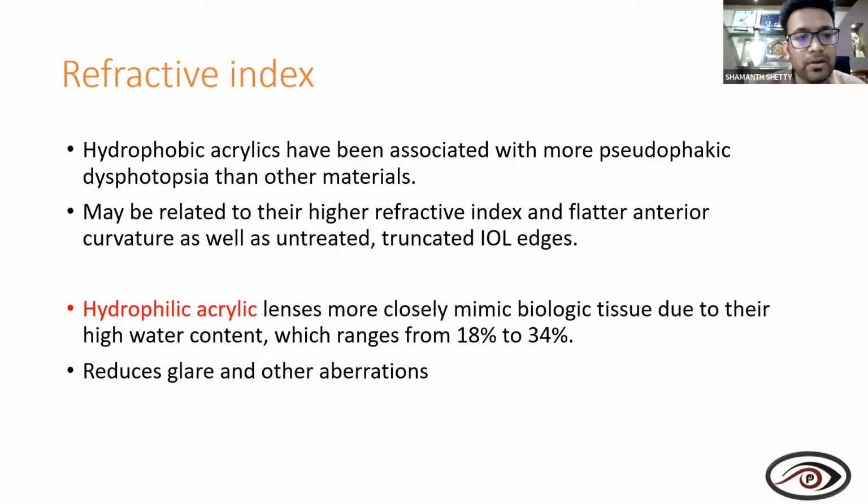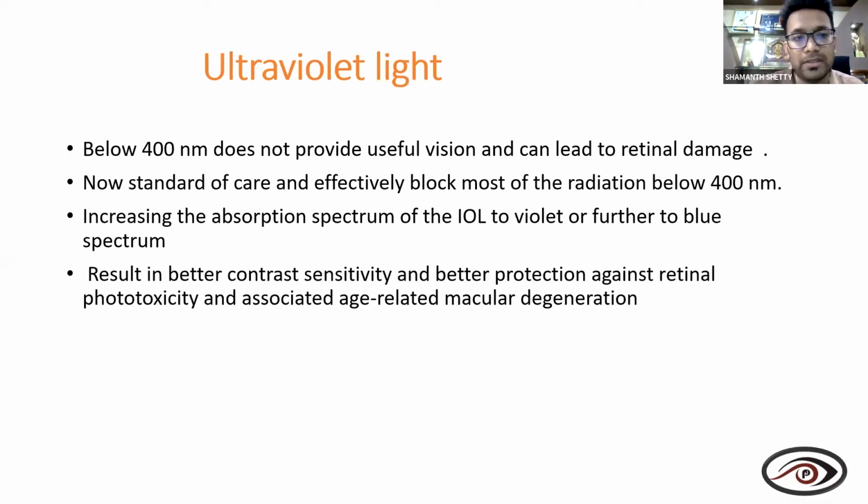Talking about refractive index, the hydrophobic acrylics are associated with more pseudophakic dysphotopsia than any other material. Hydrophilic acrylics usually mimic biological tissue due to their high water content. So basically, that's why the hydrophilic IOLs reduce the glare and other aberrations compared to hydrophobic ones.